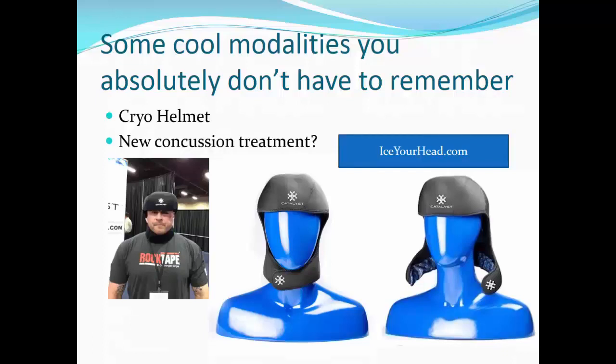This unit has been marketed as a new concussion treatment, with the theory that early application of ice or cryotherapy could help decrease the effects of concussion in much the same way as it does for acute injury. There is no research at this point in time that states the use of this cryo helmet has any effect on concussions, but it's being marketed as such a product.